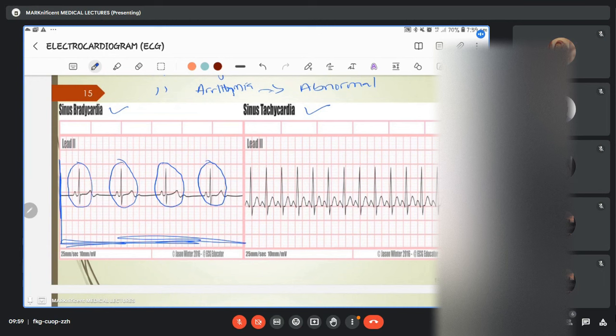I mean, heart cycle, that's pumping action itself. So what you see here in bradycardia, there's reduced heart activity. It means that it will take a longer time. This is time, remember, here. Going this way is time. So it means that it will take a longer time for the next activity to occur.